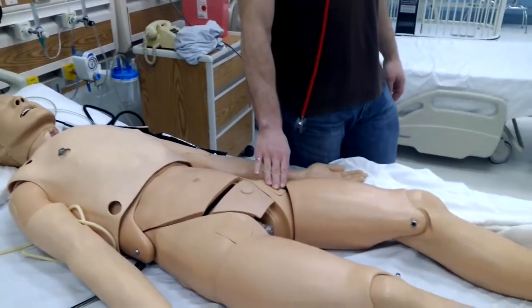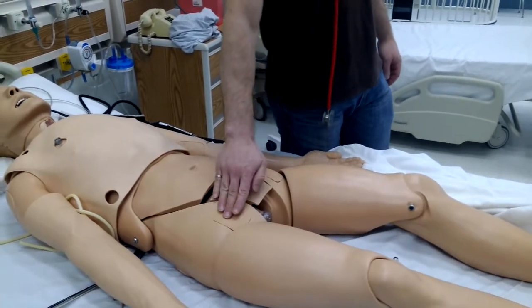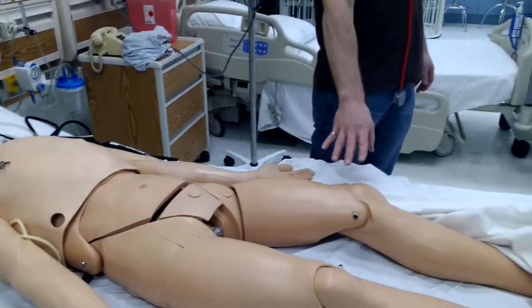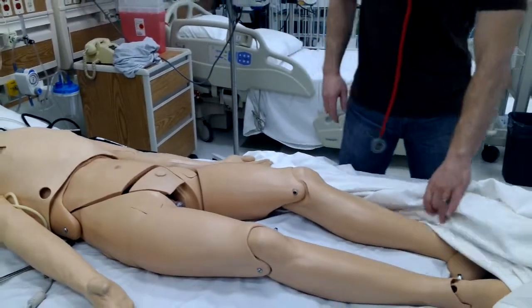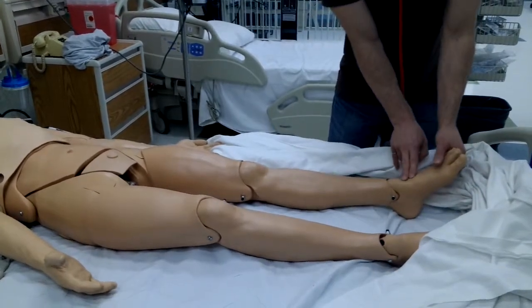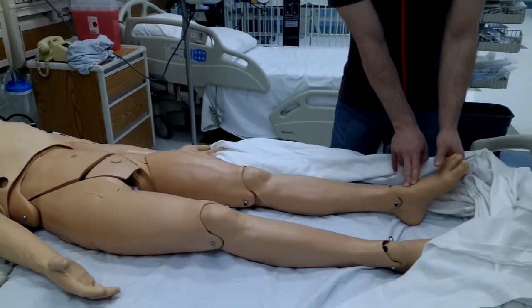We can see the two femoral pulses on either side of the pelvis. There are no popliteal pulses, and we only have one pedal pulse on each foot.